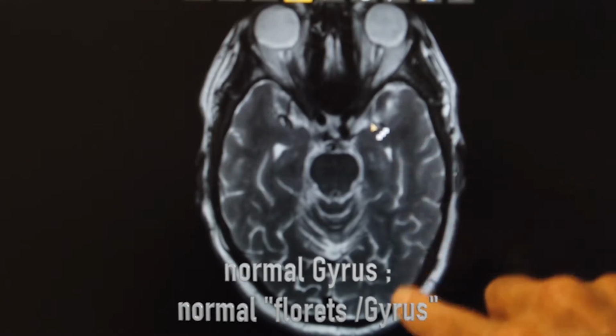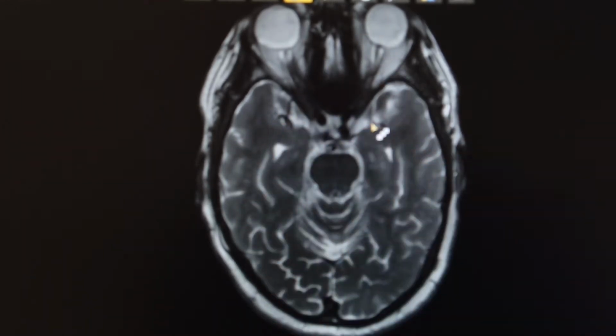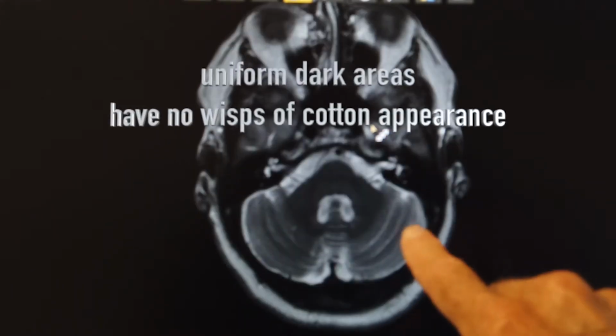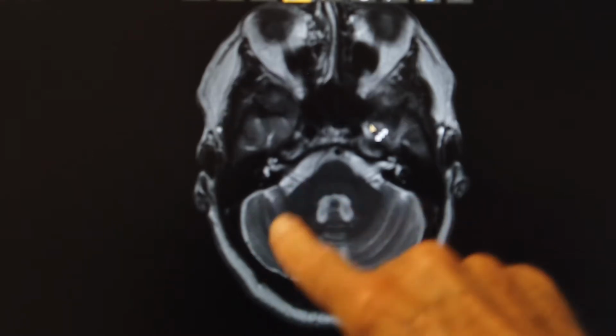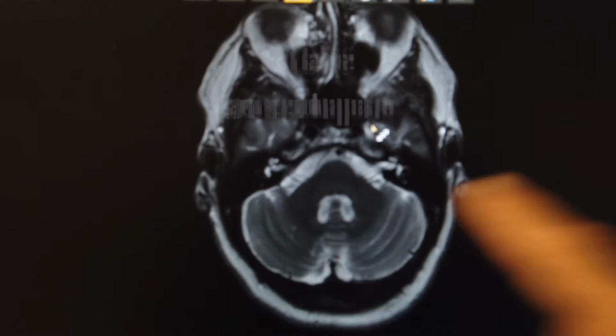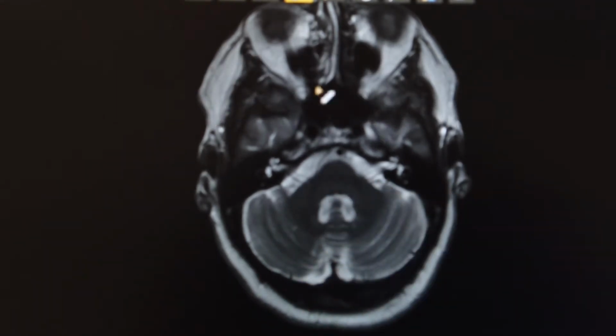And you can see the darkness in your brain is pretty much the same on both sides. No evidence of any small vessel ischemic changes. And same down here, a little lower in the cerebellum. Cerebellum, which is like a motor control, looks pretty normal. It is normal, matter of fact. Both sides look the same. These little striations, no little white matters.